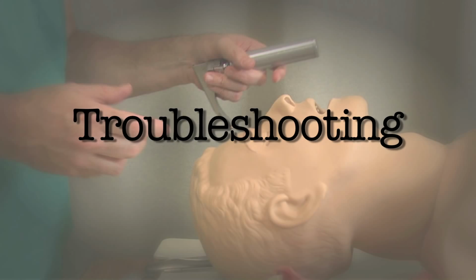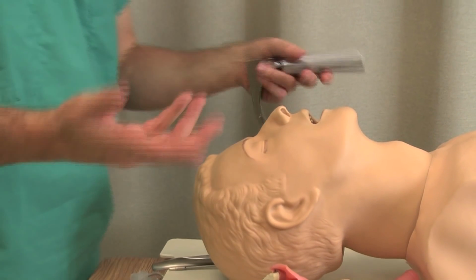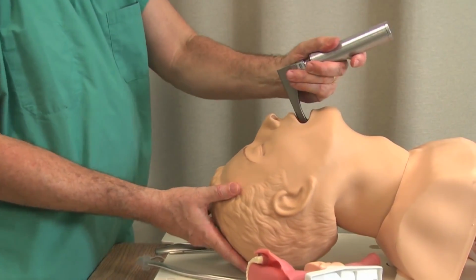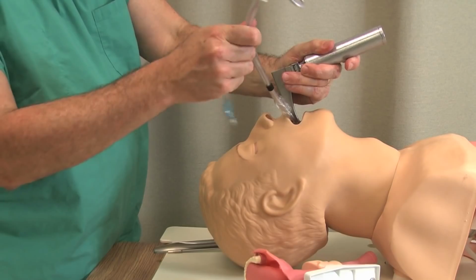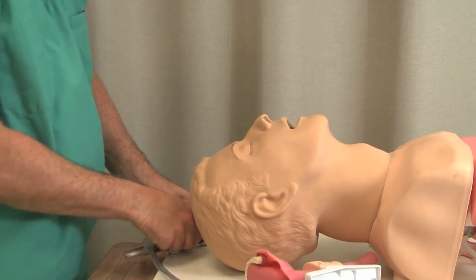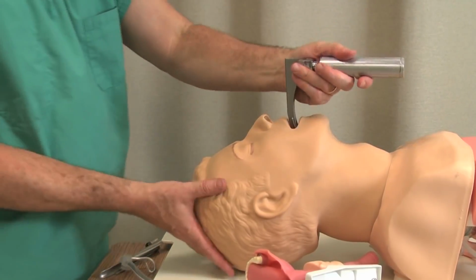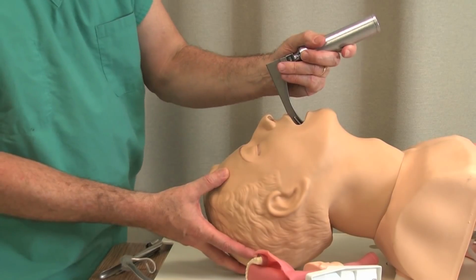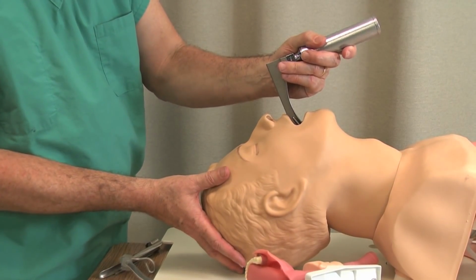I'm going to show you on the mannequin a few things you can do if things don't go right. So in a perfect world, you get them in a perfect position, you put the laryngoscope in, you get a great view, tube goes in, life is good. But life doesn't always work out that way. So you might go in and you don't have any view at all. So what do you do in that case? What do you do when you just don't get any view at all?